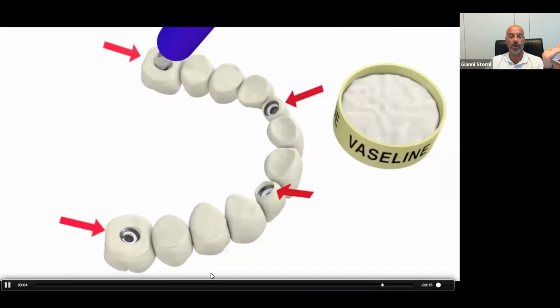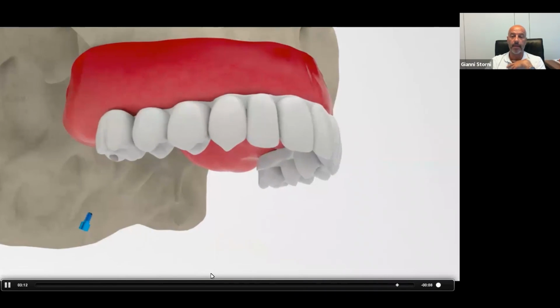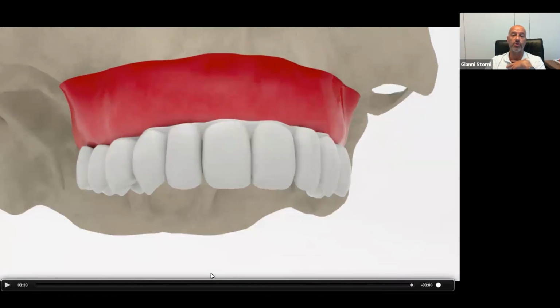And now the doctor only has to insert the denture, the bridge, in the mouth, first the anterior because it was very divergent, and then in this case the screw doesn't give us any problem, so they use 4 screws, click and screw, and the work is done as a fixed bridge, easy, temporary, waiting for the final one.